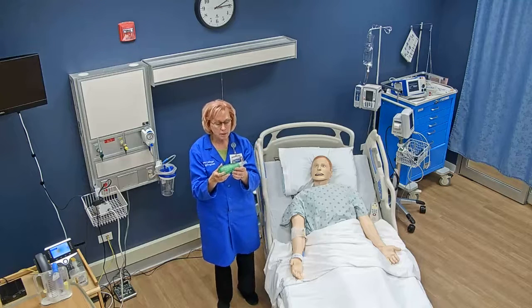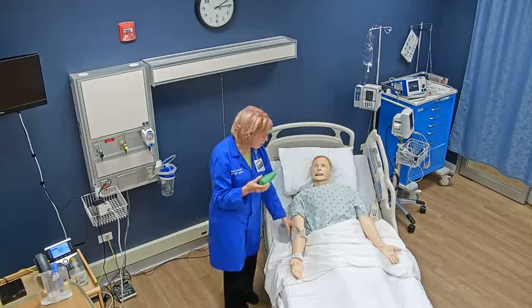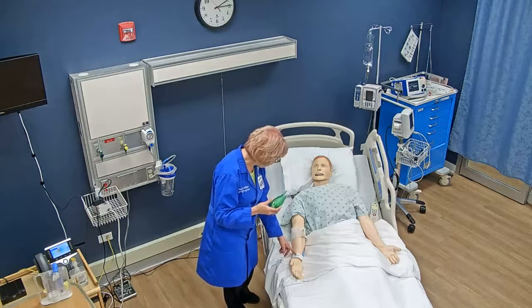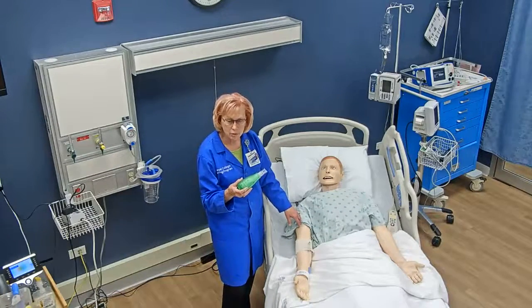So when I go into my patient's room, my first step as I enter the room is to verify my patient. This is DeAndre Williams. I ask him his date of birth — 12-12-19XX — and he verifies I have the right patient with the right date of birth.